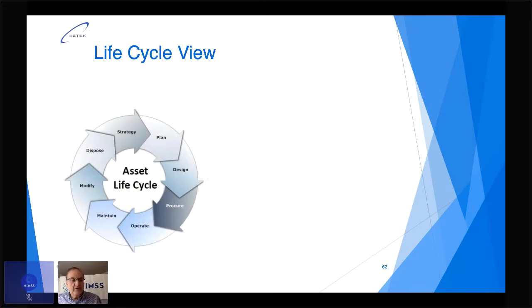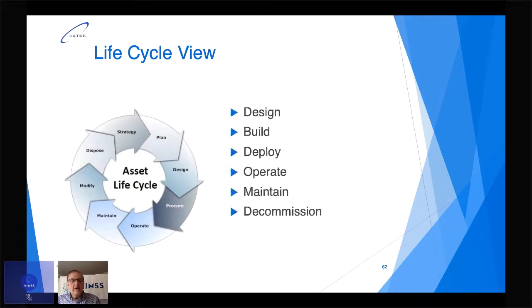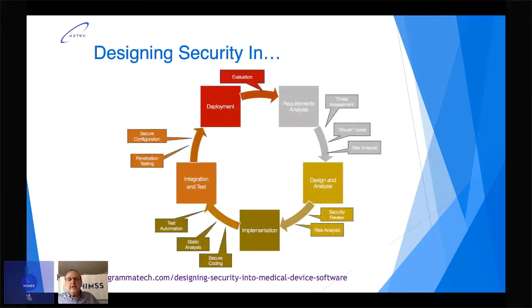Often we talk about the life cycle view of an asset, where you think about security not only in designing the device, but how it's built, how it's deployed, and I'll go through a couple of these steps. When you're doing design, I don't know if you can read the small print, but during requirements, when you're trying to think about what it is you're going to build, you have to also think about some of the things that can go wrong. And then when you're actually doing the design, making sure that security professionals have a look at it. And then when you're writing the software for it, making sure that it's done properly and that you don't introduce vulnerabilities. And when you start getting ready to deploy, there's a bunch to think about.